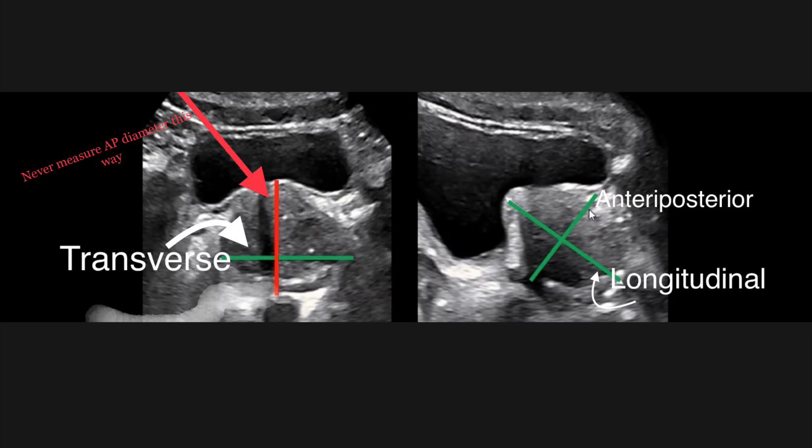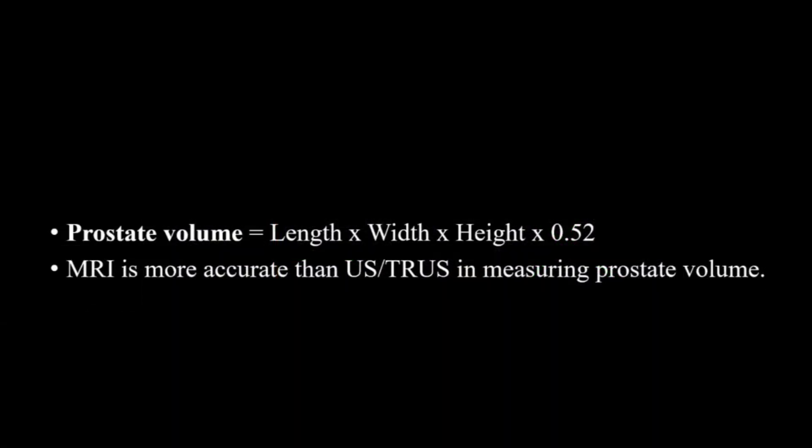This is the correct method to measure prostate dimensions. These three dimensions — width, height, and length — are multiplied by 0.52 to get the prostatic volume. Ensure the measurements are in centimeters to get the volume in cubic centimeters.